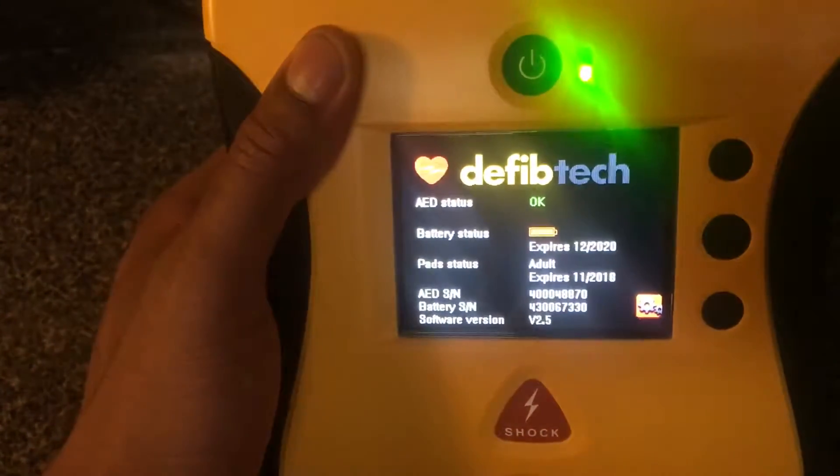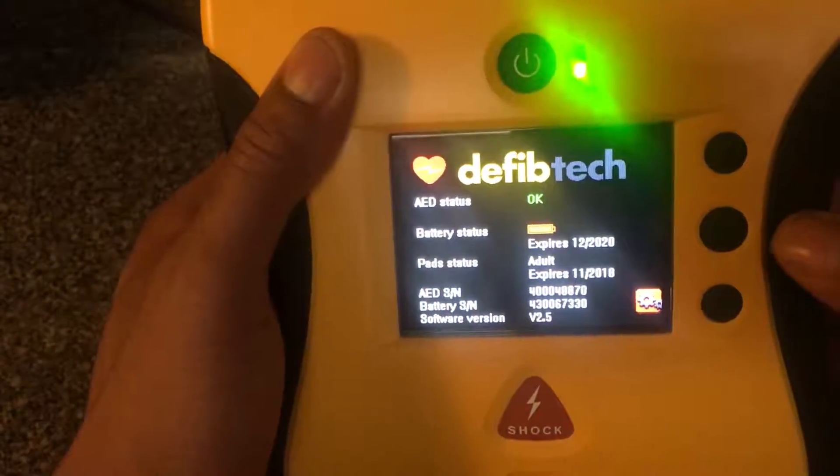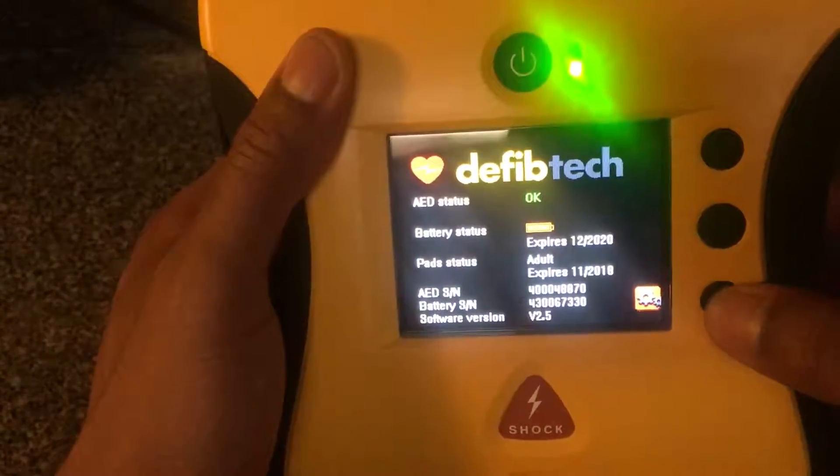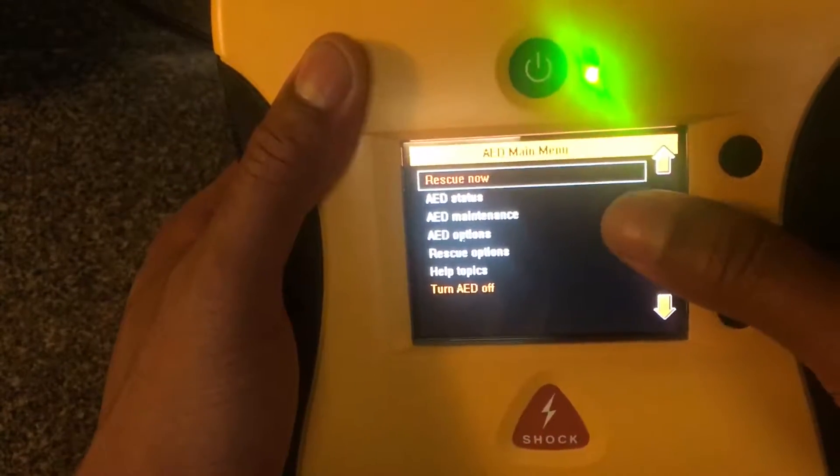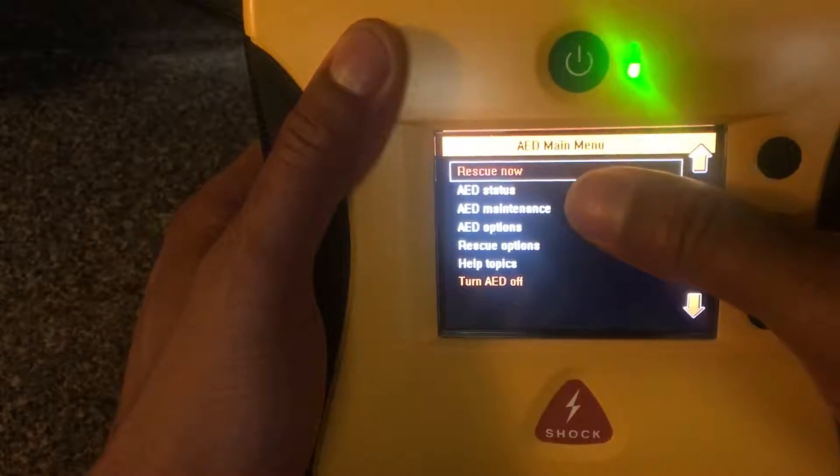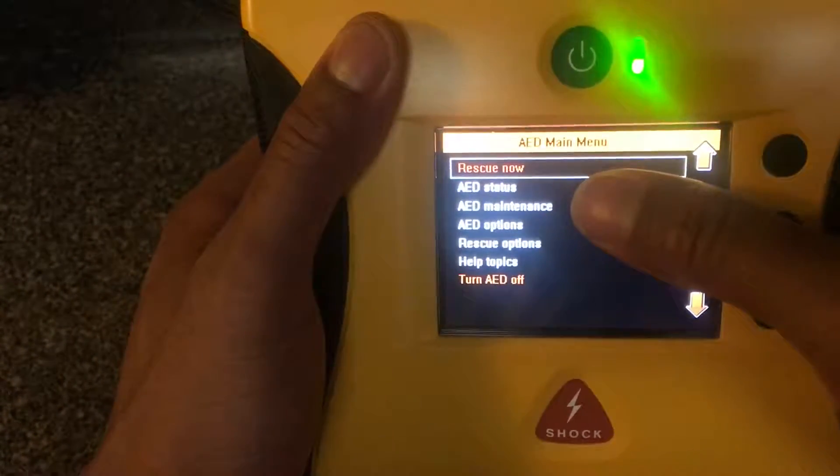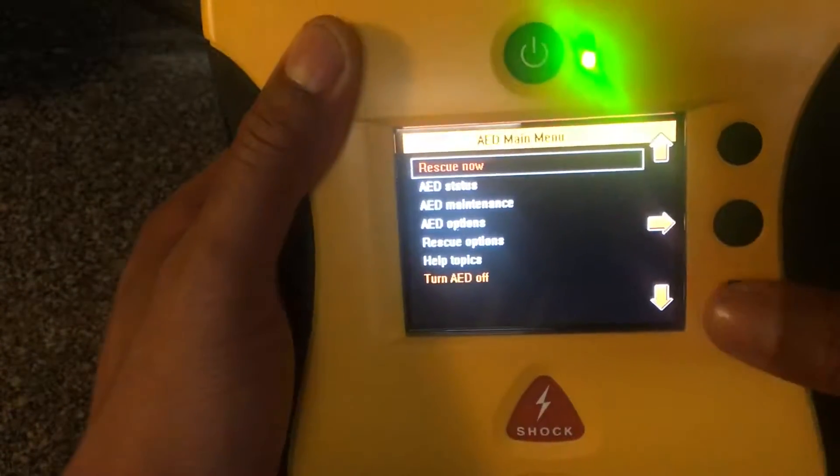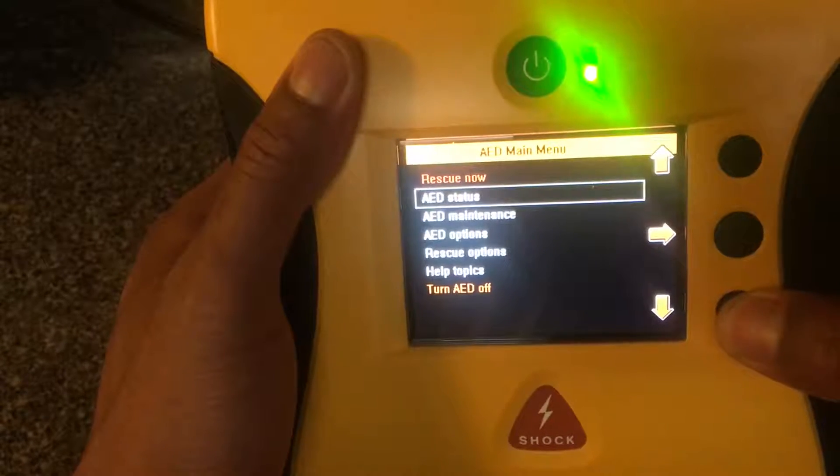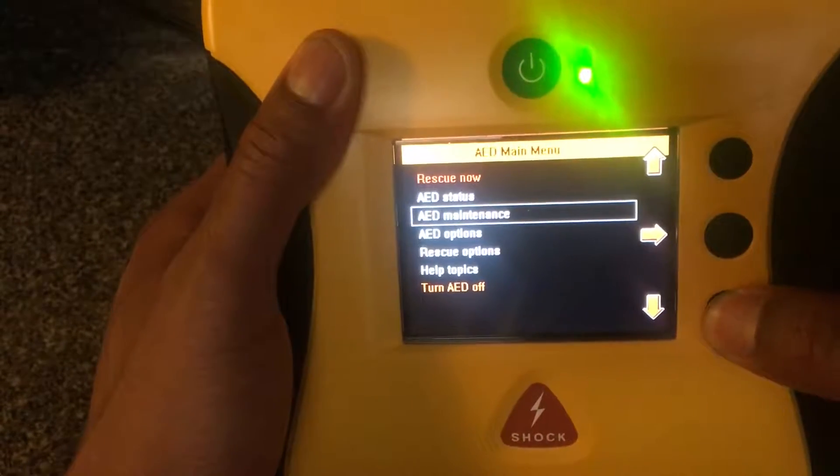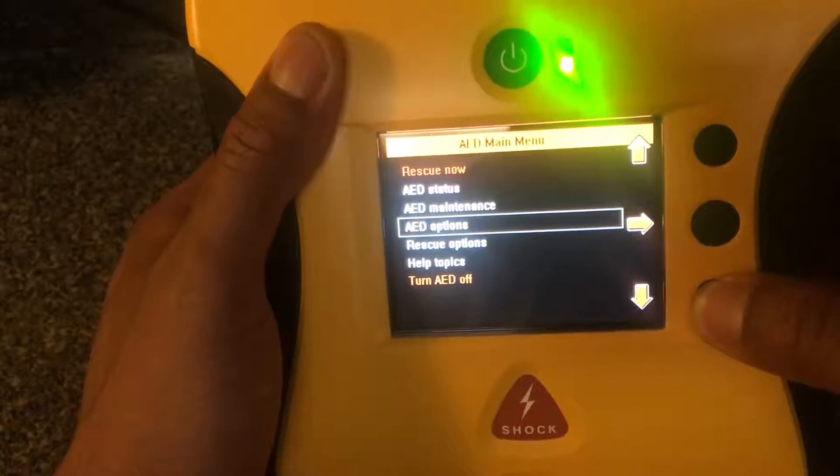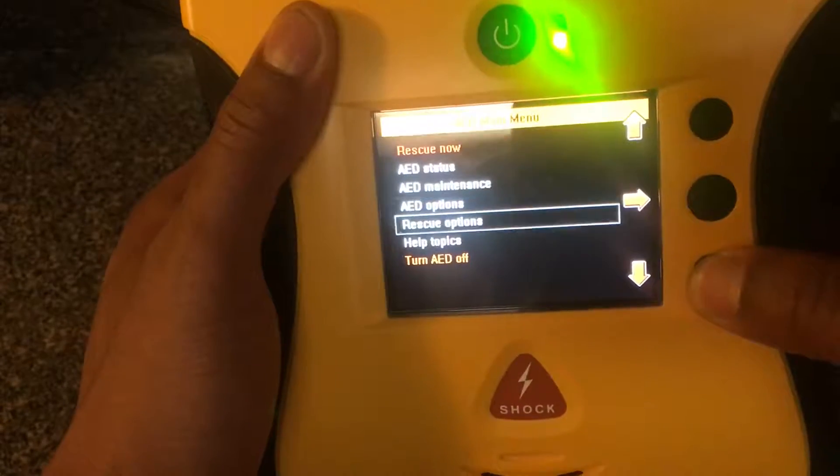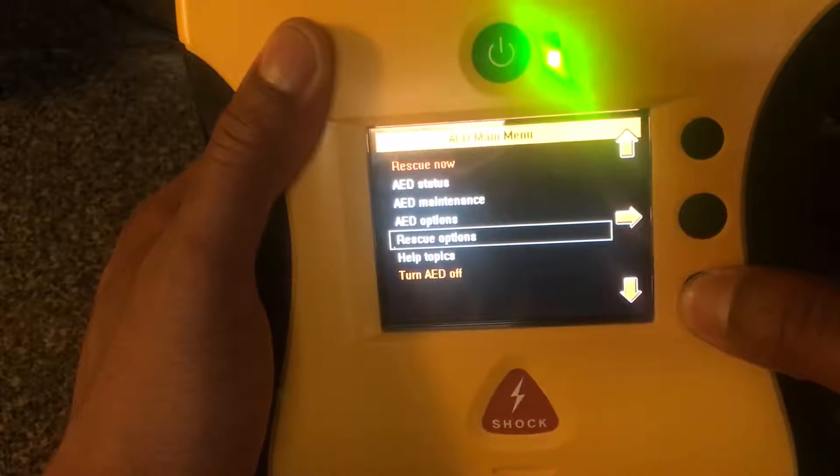You press the center button and it takes you to a screen right here. Okay, so this is the screen that we're going to go through. What you do is hit this button right here for menu.